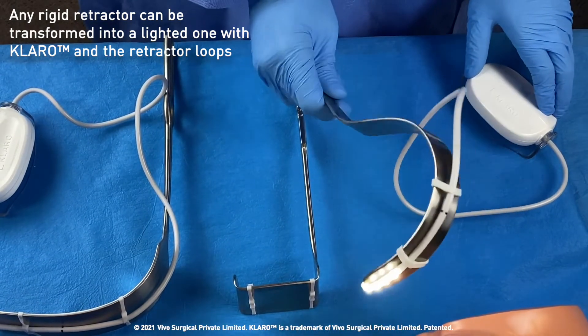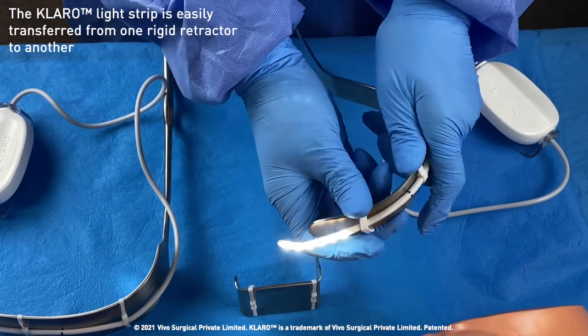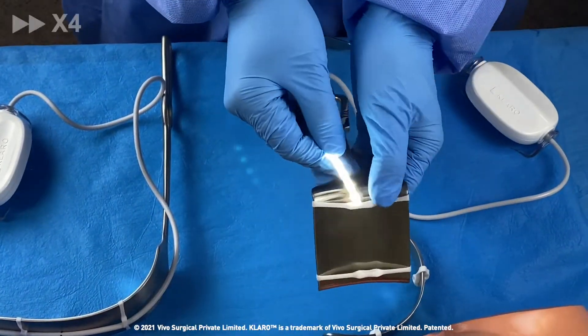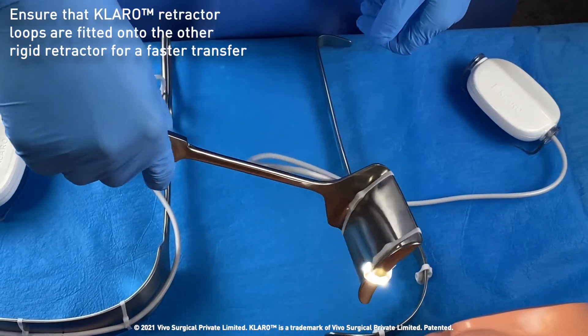If different retractors are required during the procedure, Claro can be easily removed from one retractor and transferred to another as shown. There — nice and easy.